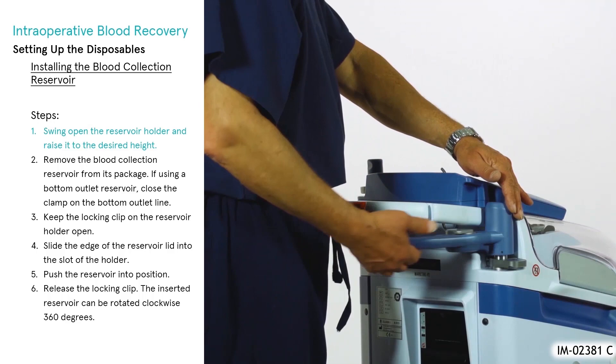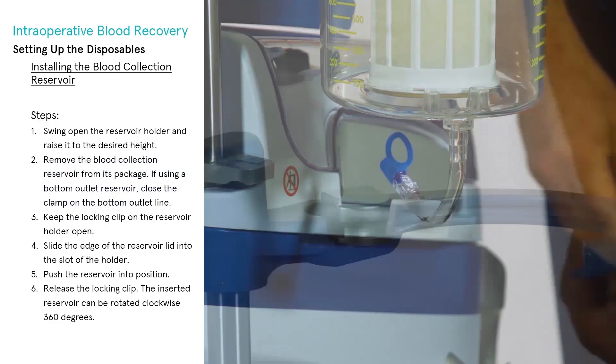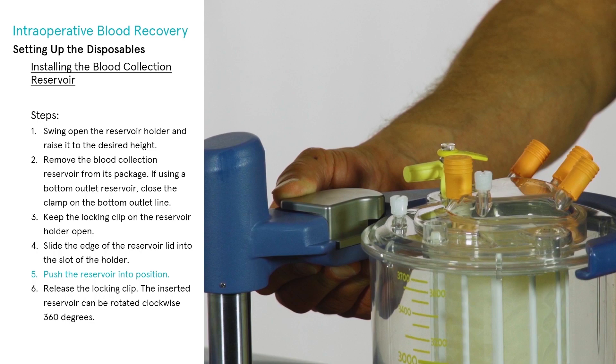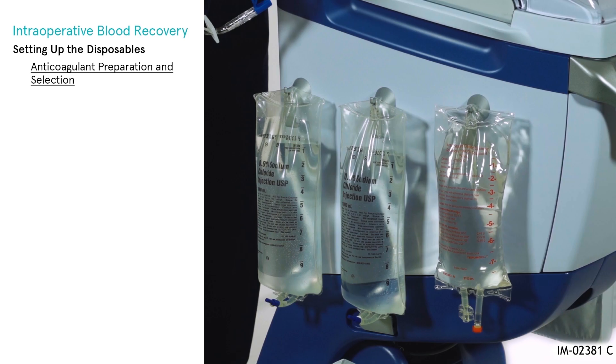To install the blood collection reservoir, swing open the reservoir holder and raise it to the desired height. If using a bottom outlet reservoir, close the clamp on the bottom outlet line. Keep the locking clip on the reservoir holder open. Slide the edge of the reservoir lid into the slot of the holder, push the reservoir into position, and release the locking clip. The inserted reservoir can be rotated 360 degrees.